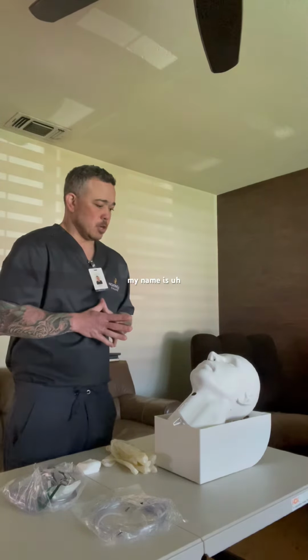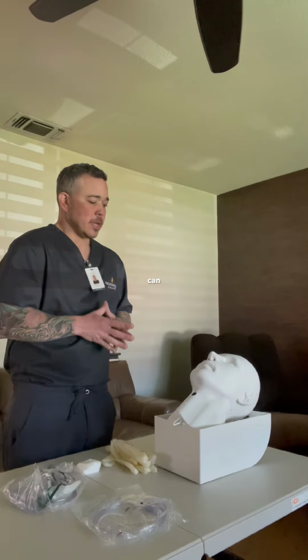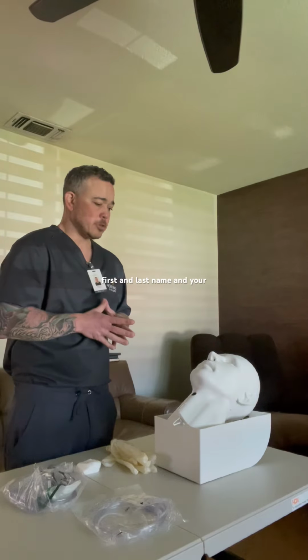The next thing I'm gonna do is introduce myself to the patient and then ask for two patient identifiers. So hi, my name is Tristan, and I will be your nurse today. Can you please tell me your first and last name and your date of birth?